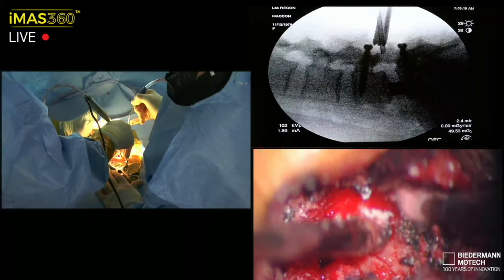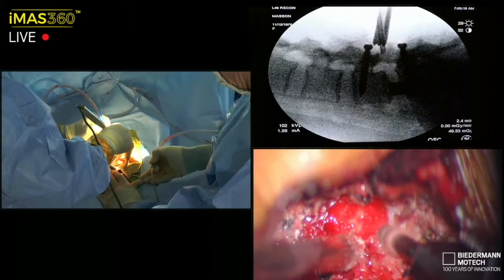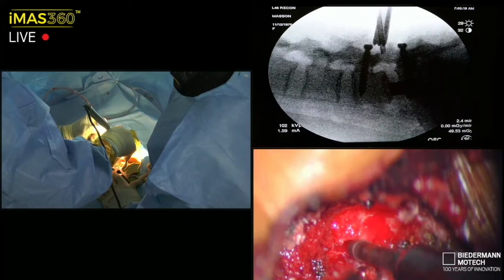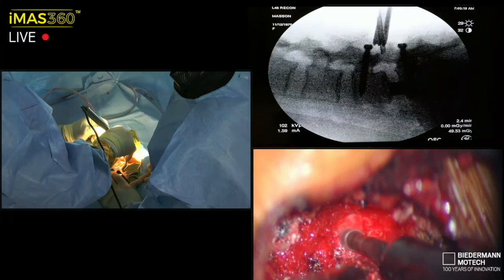So here's a little bit. I'm gonna get that proximal stuff out of the way. Okay, really close. I'm on cortical bone, high dorsal lamina. Getting down to ligament here. Okay, see that interface right there. Using the drill physically to just release that a little bit. Obviously, when I use the drill as a tool, I'm pretty mindful of where my foot is and what I'm doing there.